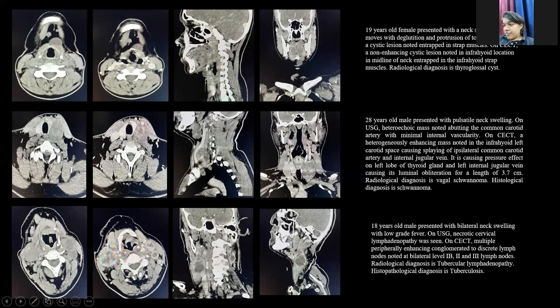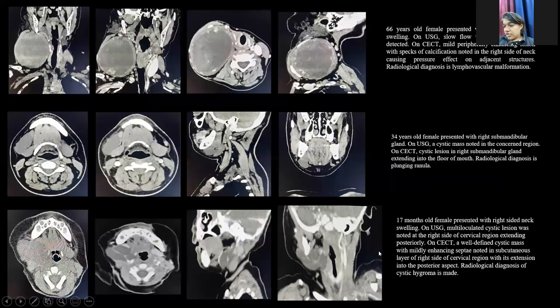An 18-year-old male presented with bilateral neck swelling with low-grade fever. On ultrasound, necrotic cervical lymphadenopathy was seen. On CECT, multiple peripherally enhancing lymph nodes were seen at levels 1b, 2, and 3 of the cervical chain. The diagnosis of tubercular lymphadenopathy was given and confirmed on histopathology.